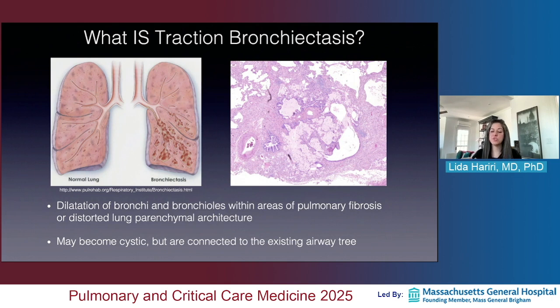And from a radiologic perspective, in some instances, that distinction may not be important when distinguishing, for example, probable UIP versus definite UIP. But from a pathologic perspective, it's actually quite important because it helps us isolate out whether there's an airway centricity to the disease or this is really truly subpleural disease, which then helps us inform what the likely etiology might be of that disease. And we'll see examples of that airway centricity in just a few slides.